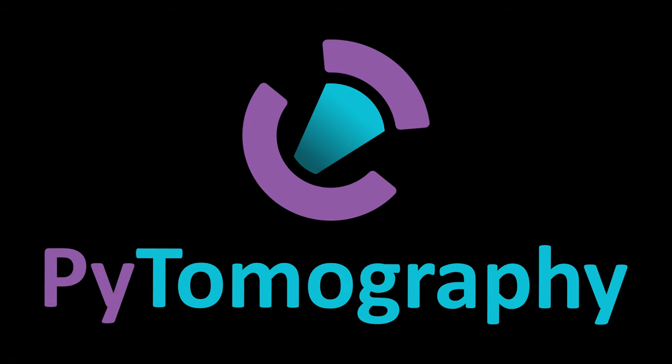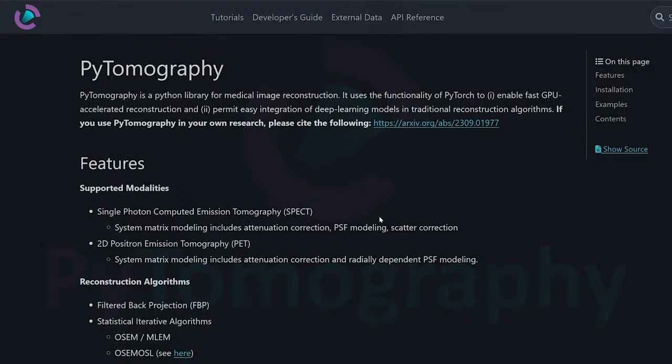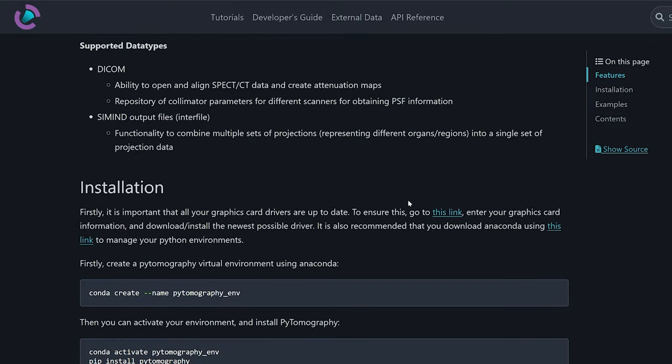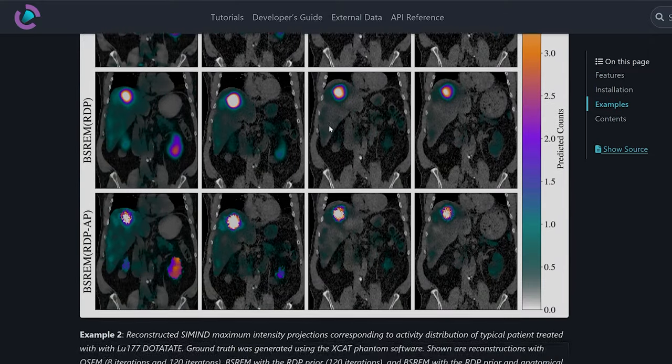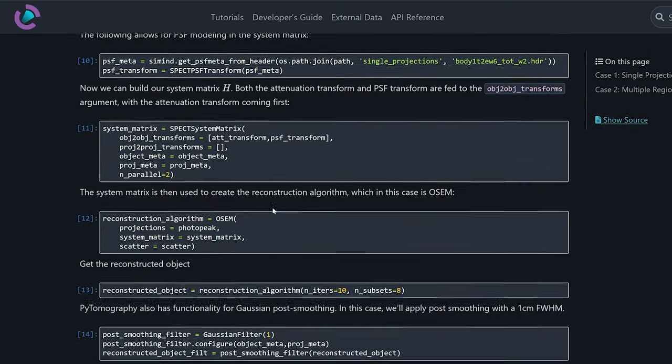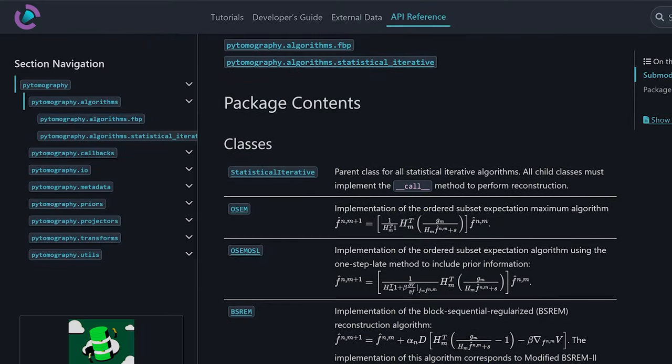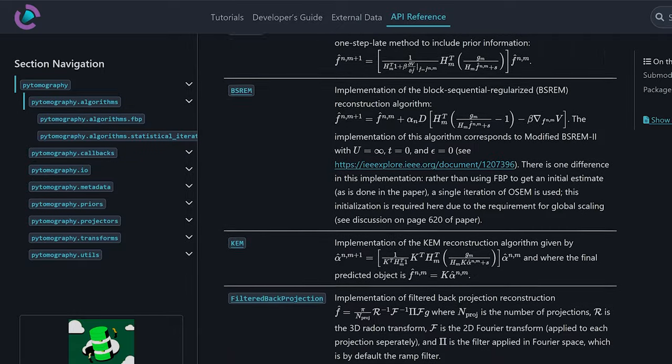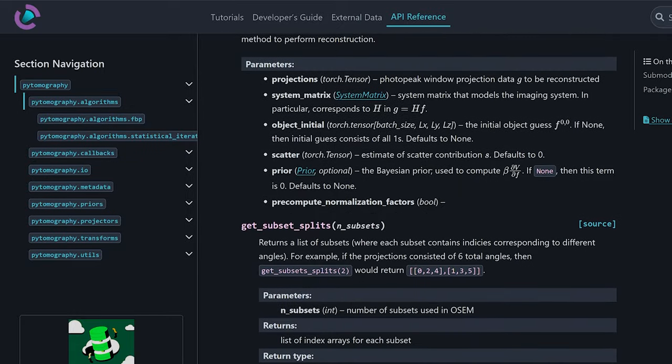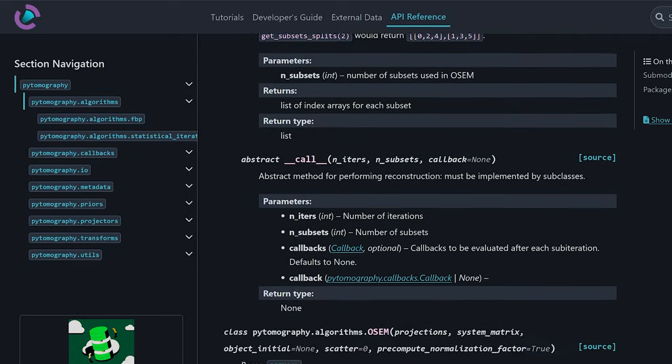Over the past nine months or so I've been building a Python library called PyTomography. There's a full website, full Read the Docs, tons of API information about all the different classes and functions, and this video is intended to be an expose of that software.